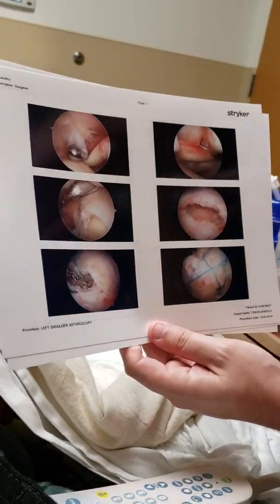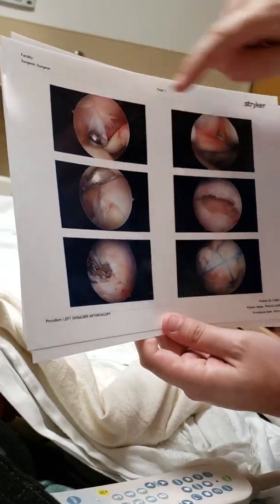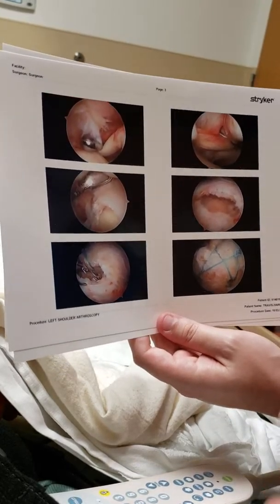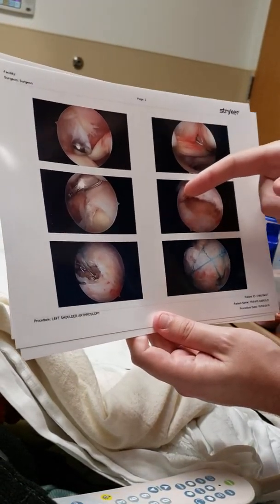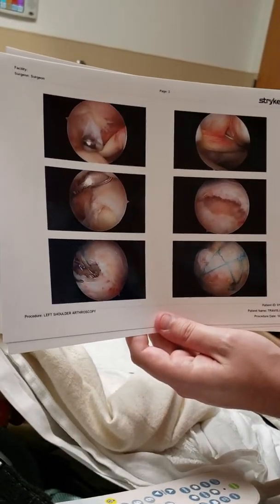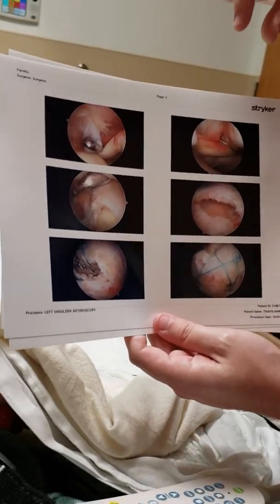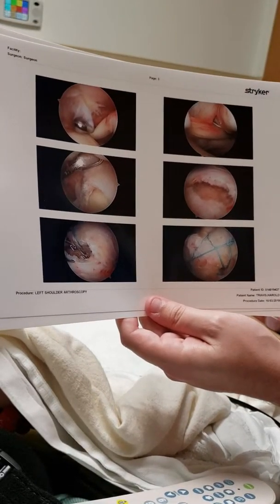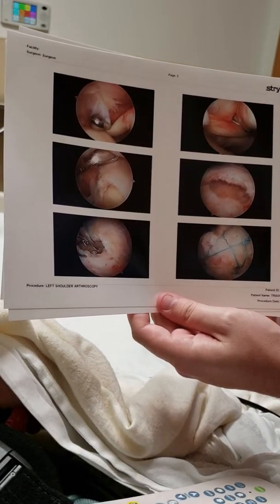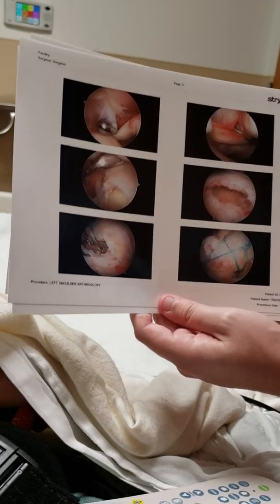Here's the tear looking at it from the side. After the frayed edges get cleaned up, this is basically what it looks like — there's a hole. Maybe a centimeter in width, maybe a little bit more. It looks way bigger on a magnifying camera but it's about that. The rotator cuff is normally about two centimeters, so approximately half of it is torn. It's a full thickness tear — that means it goes all the way through.